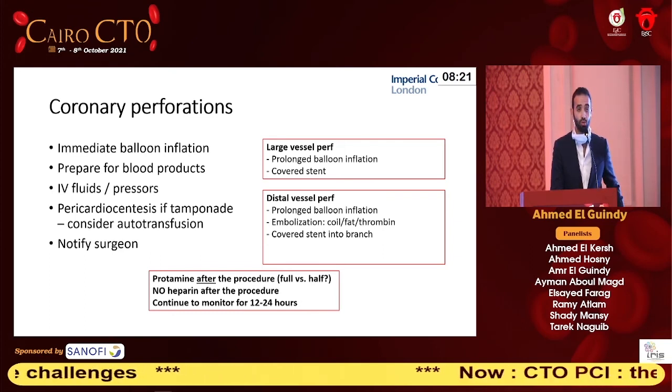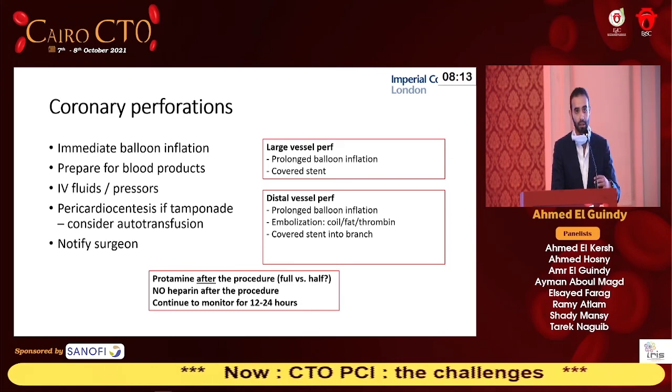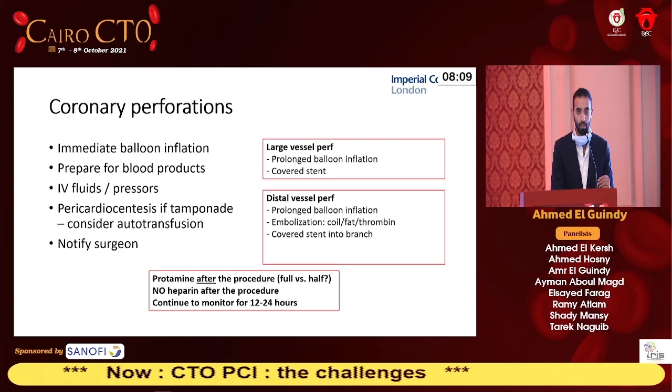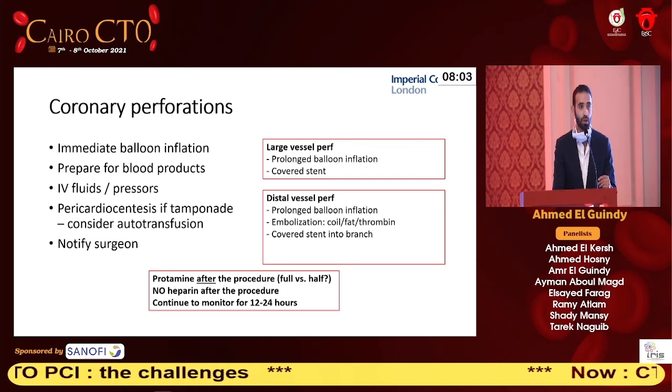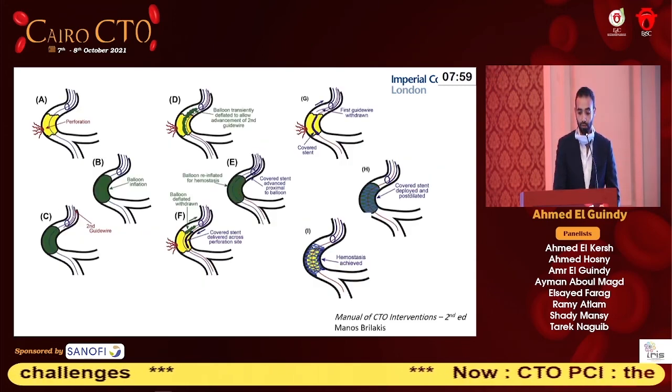Importantly, we do not give protamine until all the gear is out. Otherwise, you'll be dealing with a double jeopardy where you're dealing with a perf on the one hand and thrombosis on your gear on the other hand. We also do not give heparin after the procedure for the first 6 to 12 hours, and those are definitely not patients for same-day discharge. You want to keep them monitored for 24 hours.